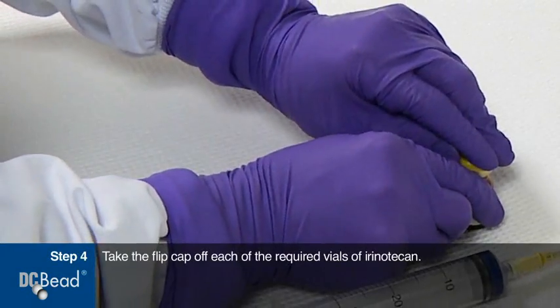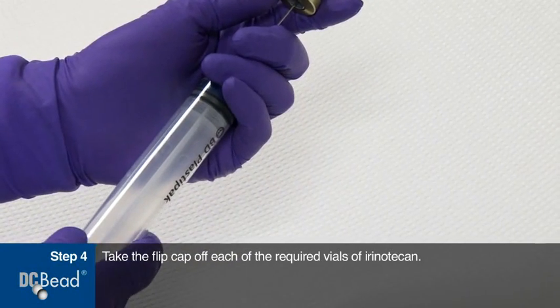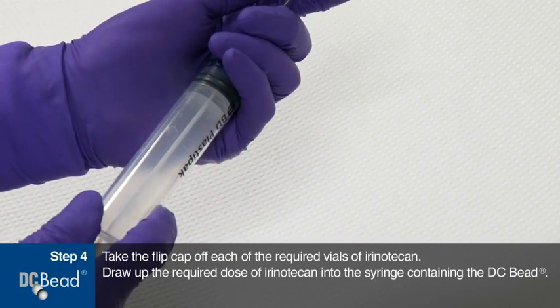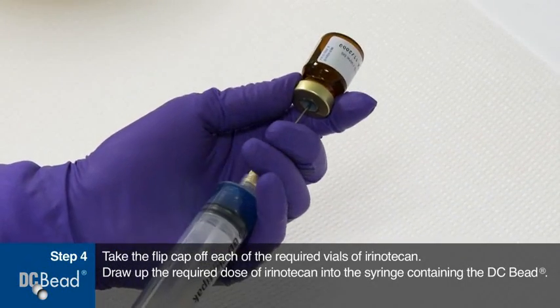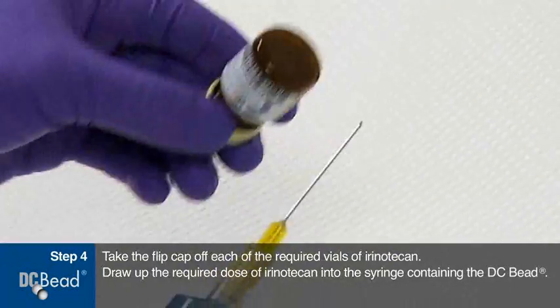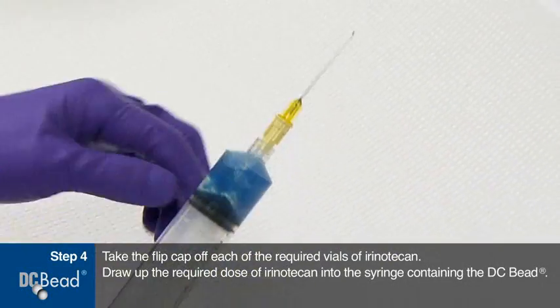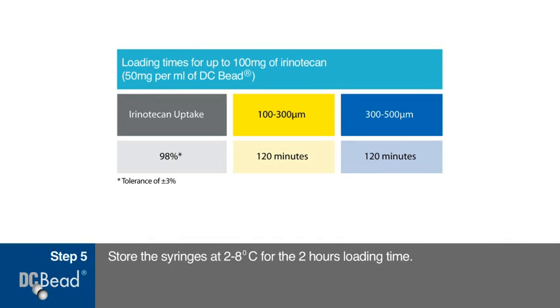Take the flip cap off each of the required vials of irinotecan. Draw up the required dose of irinotecan into the syringe containing the DC bead. Store the syringes at between 2 and 8 degrees Celsius for the 2 hours loading time. Gently agitate the mixture occasionally during the loading time.